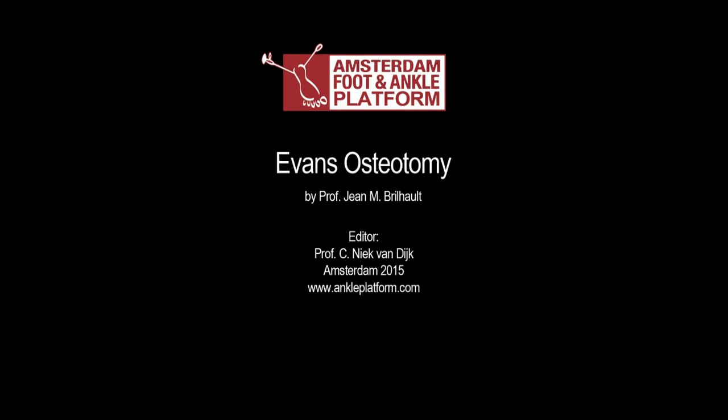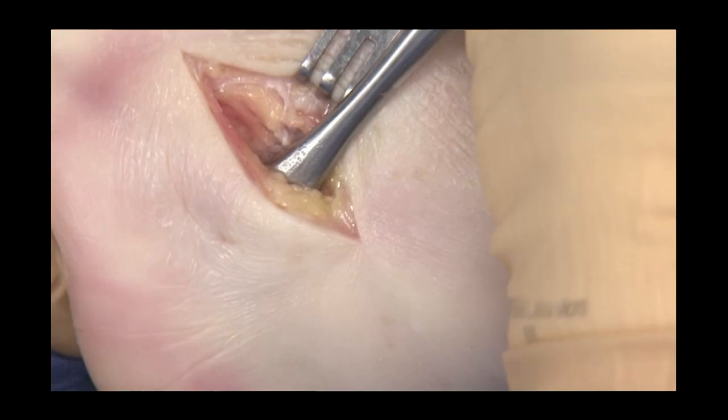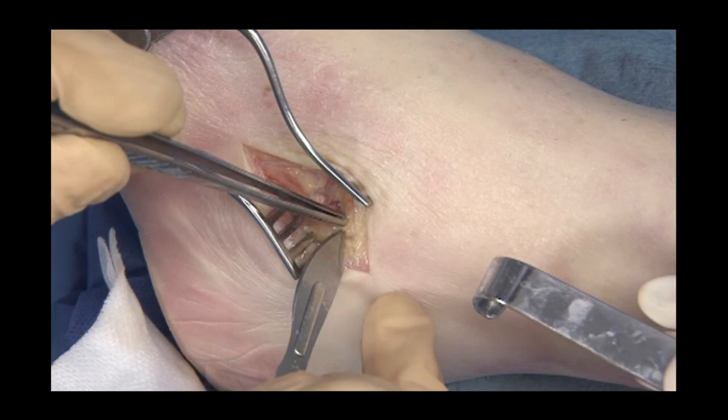A modified Evans osteotomy is illustrated here. A longitudinal incision is centred on the sinus tarsi. The peroneal tendon sheath is reflected plantar and detached from the lateral wall of the calcaneus, with resection of the peroneal tubercle if required.